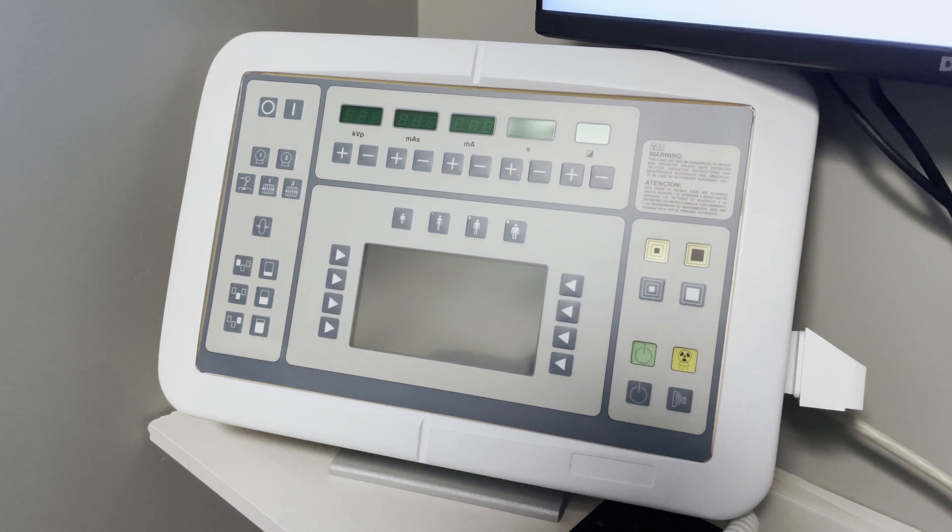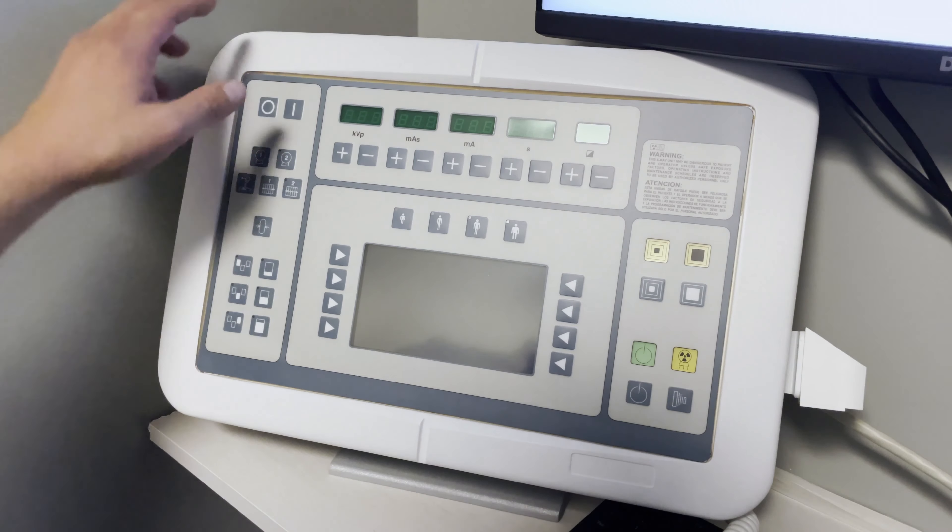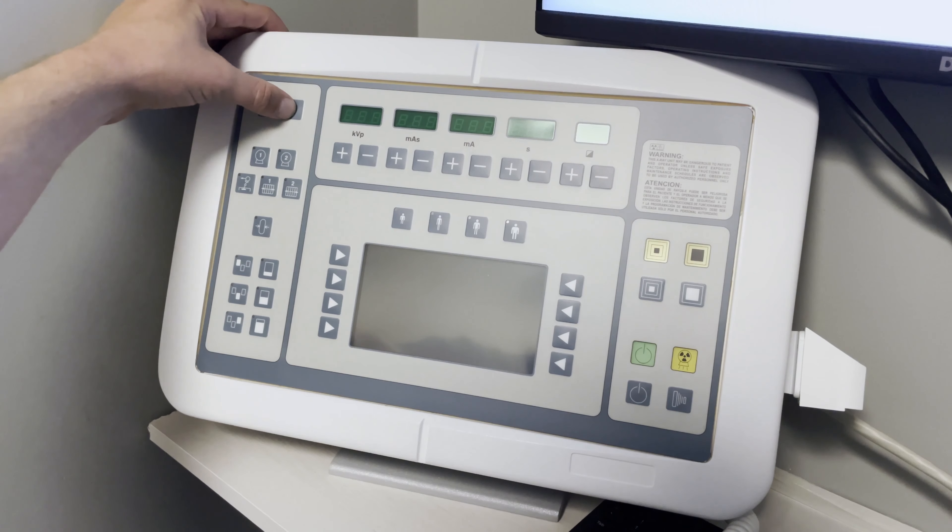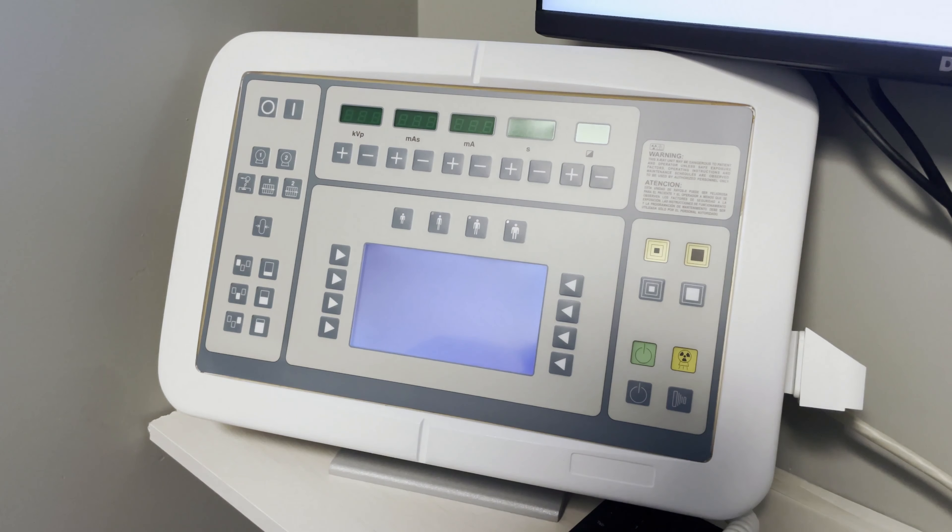Today we're going to go through how to calibrate the TXR Setacal generator. This particular generator is a 32kW generator and we're going to start by hitting the I button, which is the on button. When we hit the I button, it's going to go through a series of tests here and once it's ready we can start the calibration.